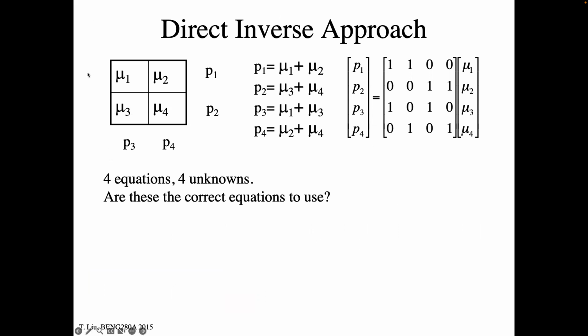If we use this principle where a ray that's coming through here gets attenuated by the mu value in this volume and the mu value in this volume, then the projection, from that equation we just saw, is just the summation of those two mu values. This is after taking the log of the data.